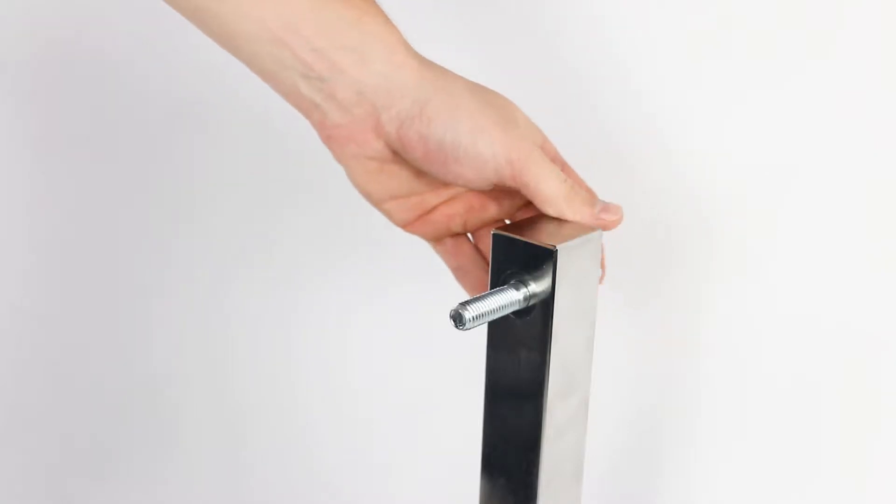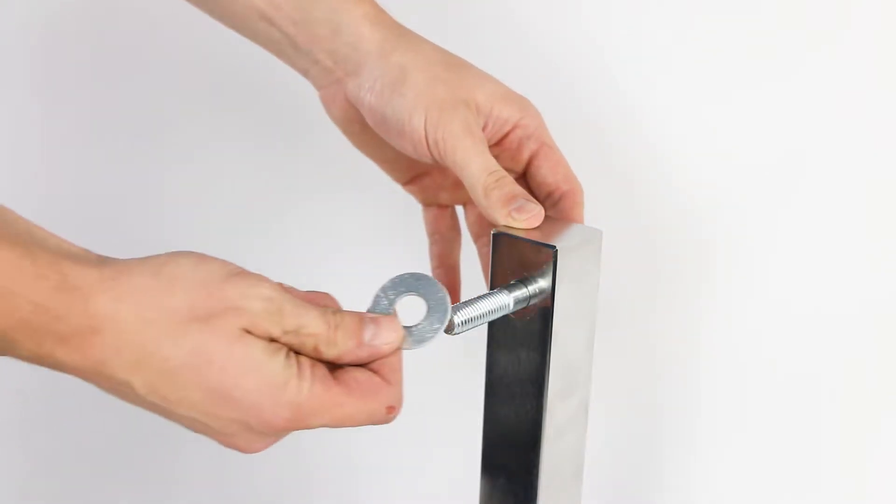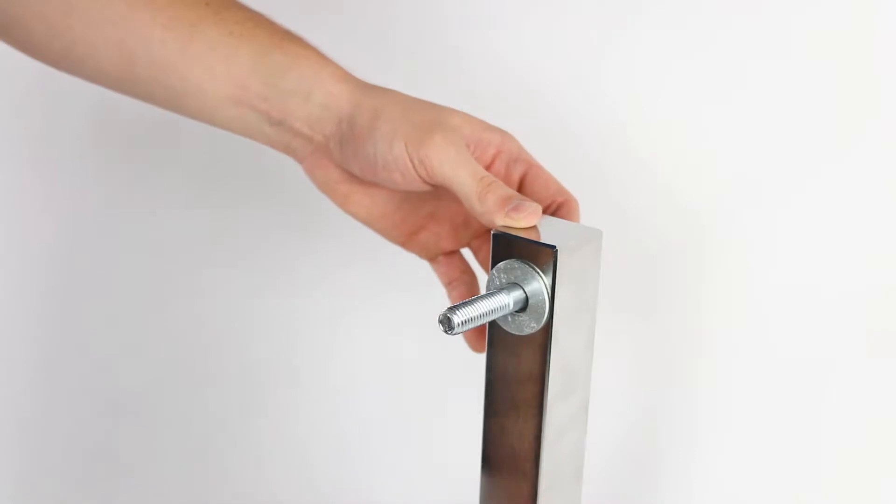Using the two bolts supplied, bolt the two arms against the inside of the two vertical posts. Place a large washer between each arm and post.